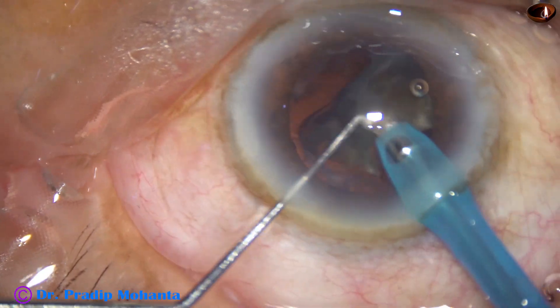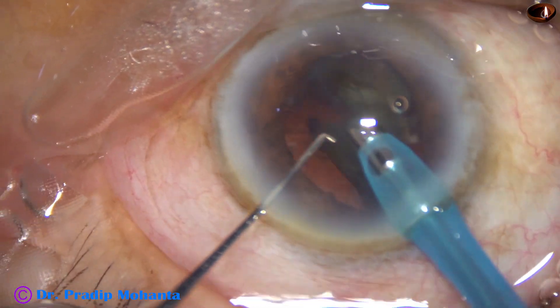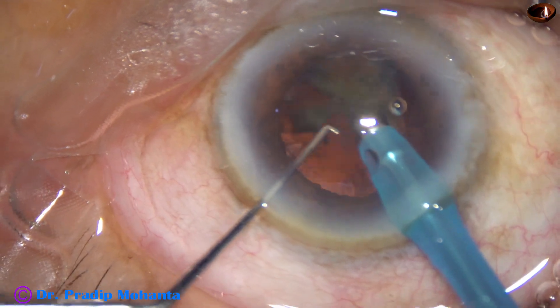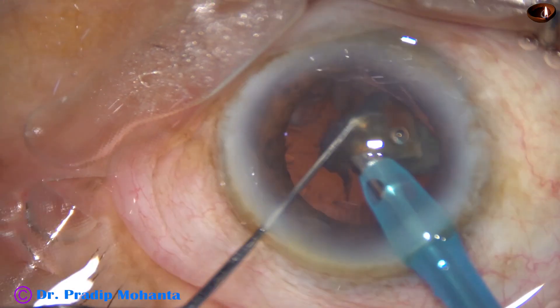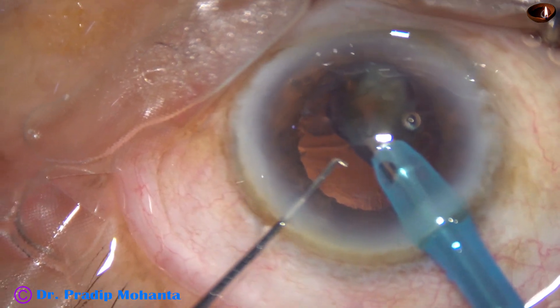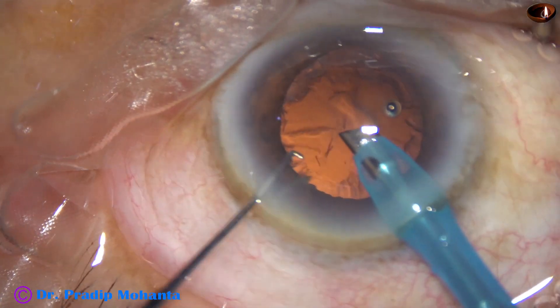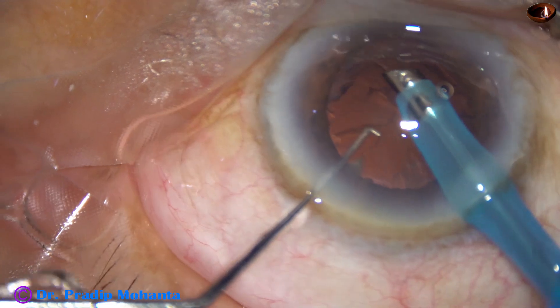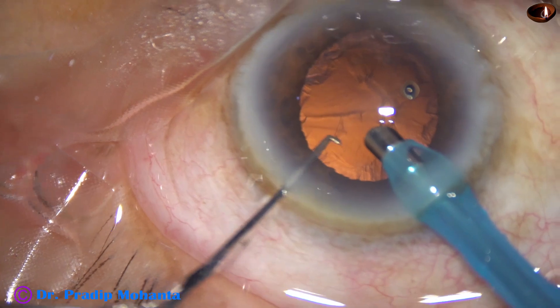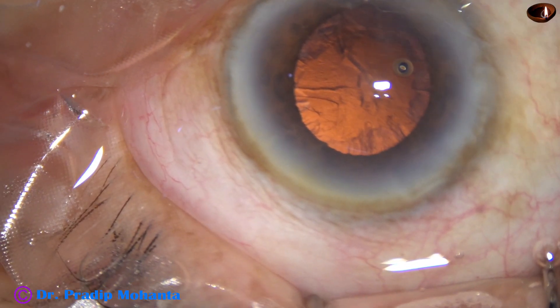Again, this is a big piece so I use the chopper to manage this piece. The anterior chamber depth is fine. No iris incarceration at this time. But see, a small nuclear piece is at the side port and it is not visible at this time.